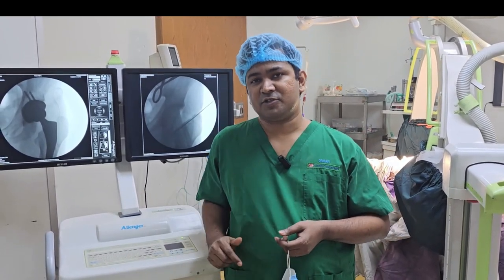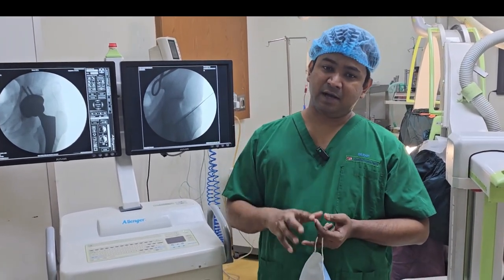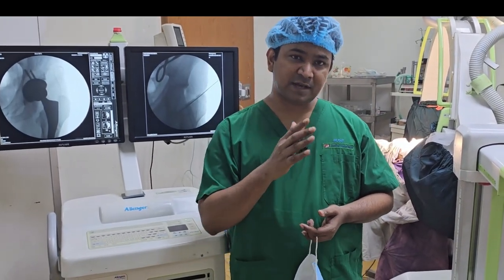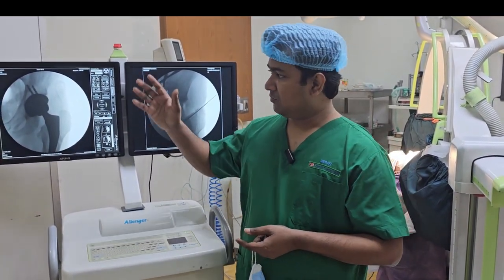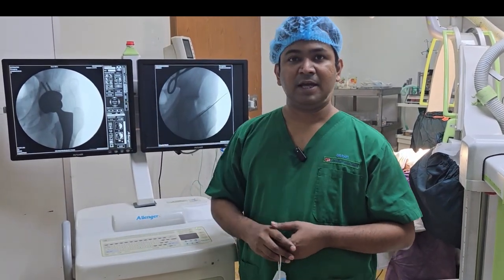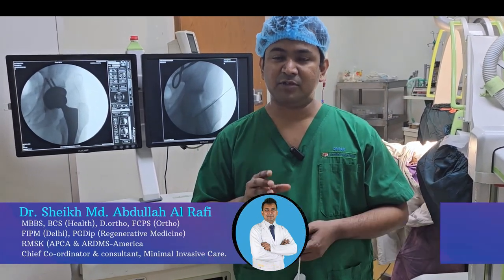This has been a successful operation. Starting from pre-operative planning and pre-operative preparations, infection control, a dedicated modular operation theater with laminar airflow — we ensured proper cap and stem selection, proper neck cut, and proper femoral stem preparation. Tactile feedback along with fluoroscopy guidance were all key elements in achieving good outcomes with total hip replacement.